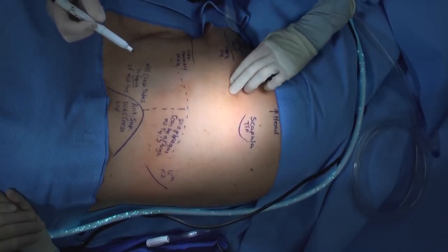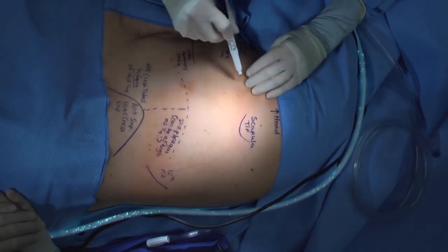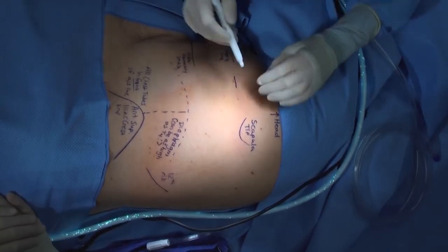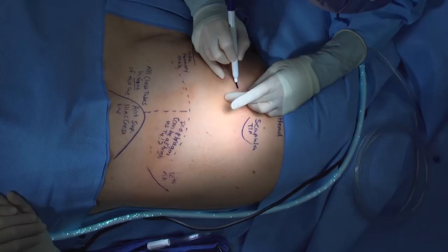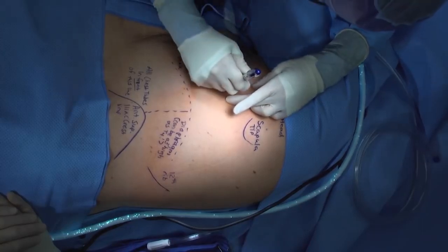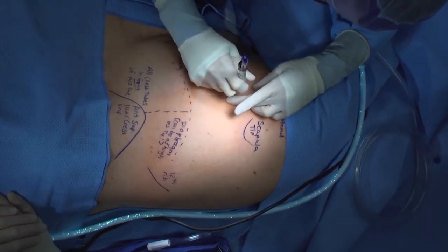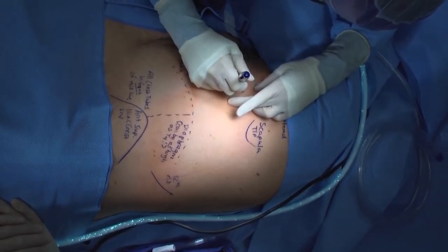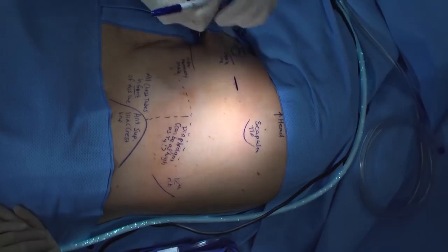Lateral to the nipple is a safe place in most patients for chest tube insertion. Before even beginning to prep or drape your patient, plan your incision. It can be very helpful to use a marking pen to mark out your incision before you even begin to make sure that you have a very firm idea of where you want to place your tube.